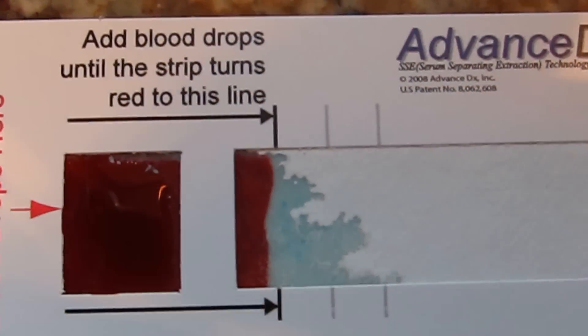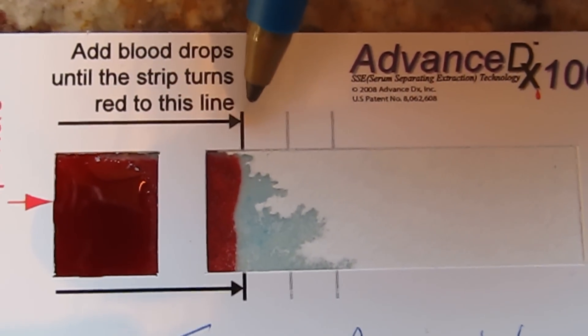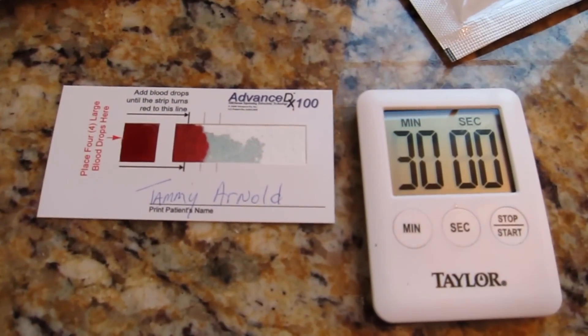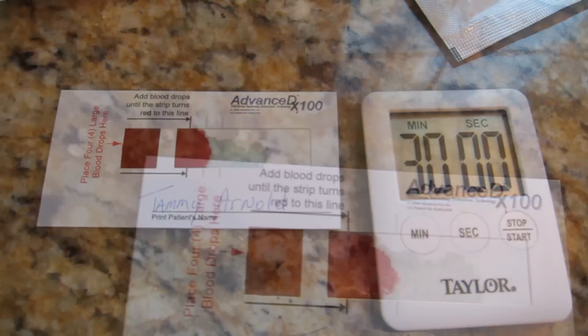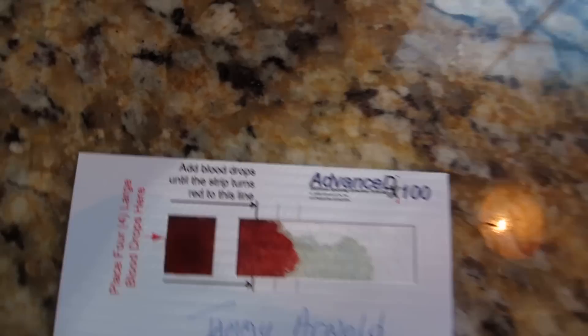The box on the left should be red and also red to the first line on the right, with a grayish color to the right of the blood. Now allow the card to air dry for 30 minutes. After 30 minutes your card should look something like this.